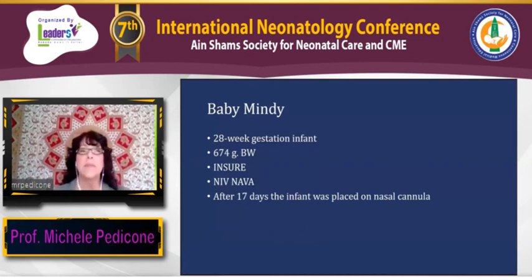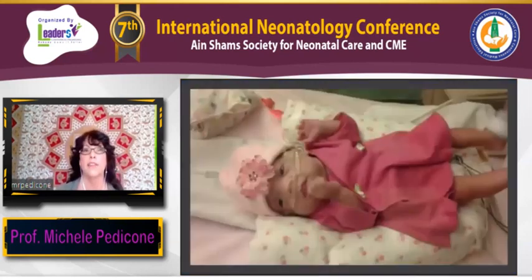And baby Mindy was a 28-week gestation infant who was only 674 grams. That was her birth weight. So we proceeded to do INSURE with her. So intubate, surfactant, and then extubate, and put her directly to non-invasive NAVA. And after 17 days, she was placed on a nasal cannula. And there she is, looking all sweet and happy.